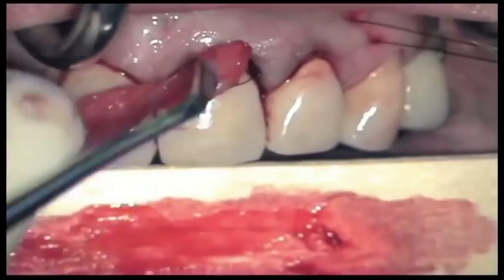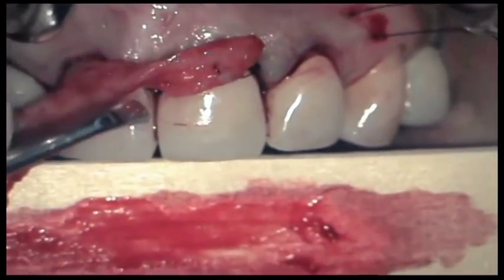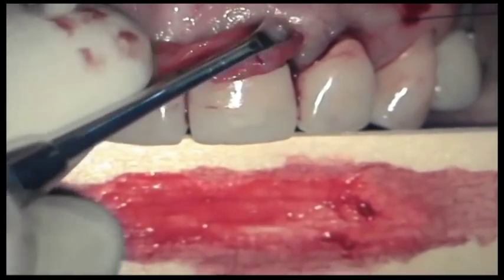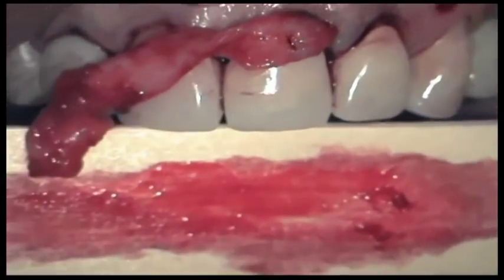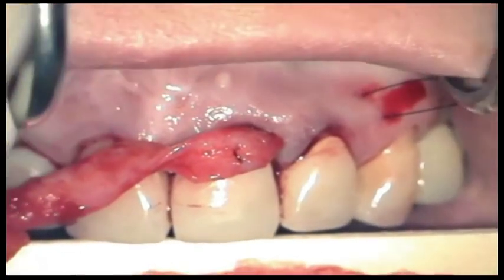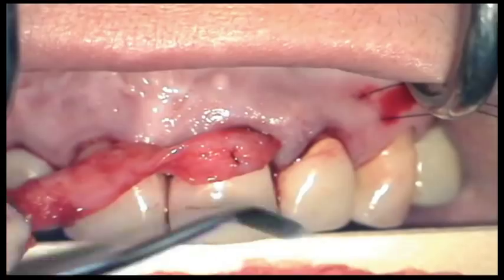Through sling sutures, we patiently introduce the graft into the envelope. While pulling with one hand, we push with our instruments with the other hand.